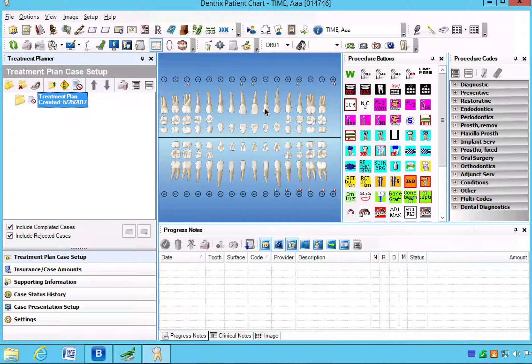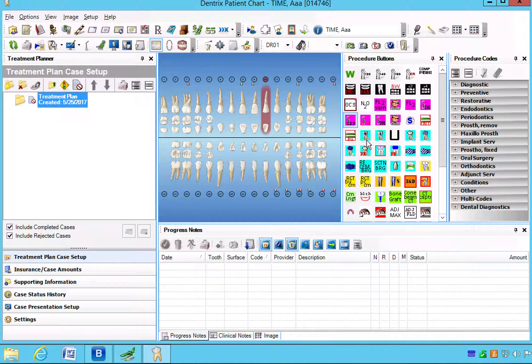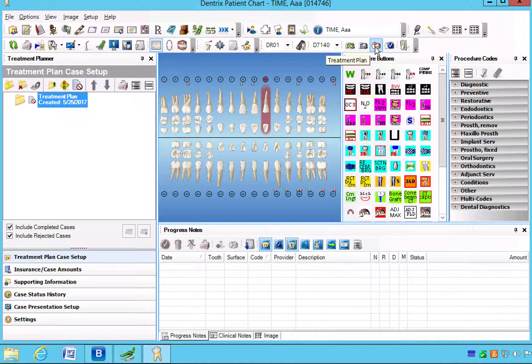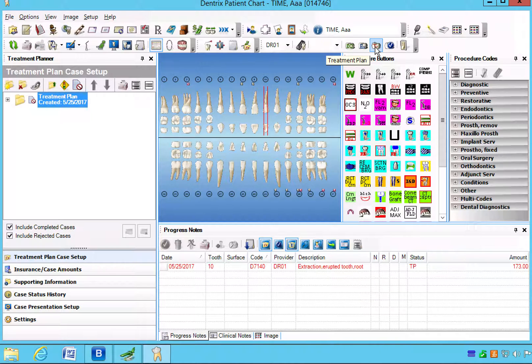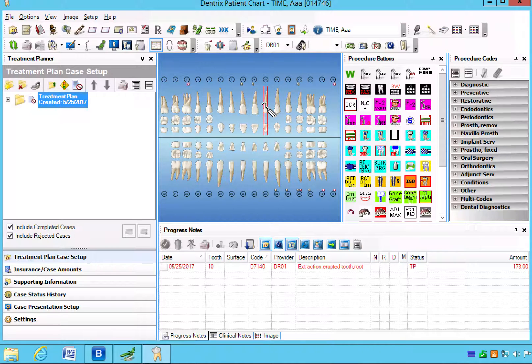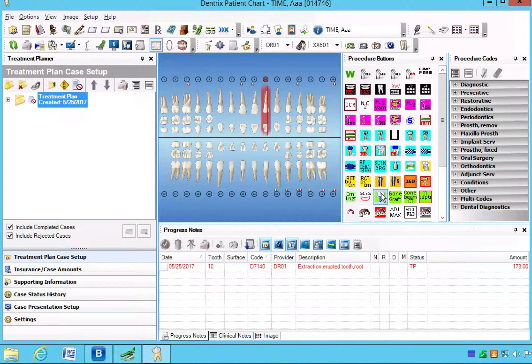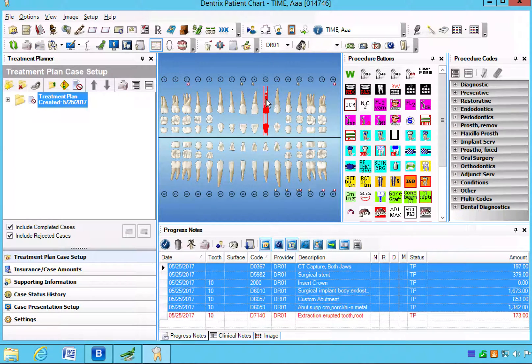For this patient today we're going to pick an extraction on tooth number 10 because it fractured to the gum line, has to come out, mandatory. There's no alternatives to that particular treatment so the tooth needs to come out. Now what we're going to do is figure out what are our options for replacing it, and this is where the alternate options come in, which would be the dental implant and a 3-unit bridge.